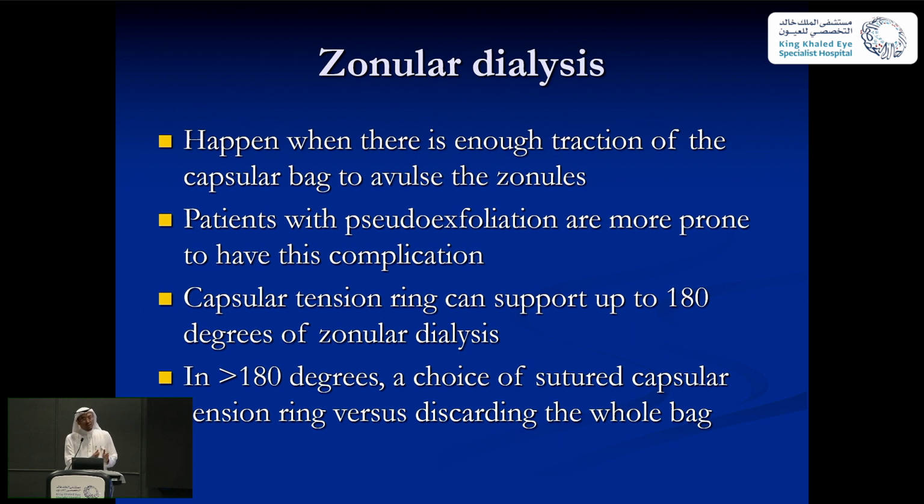So I see people cracking like this, and then having the chopper and doing certain maneuvers that are not good for the zonules. If the zonules are good, they might withstand your procedure, but if the zonules are already bad, you don't want to do this.